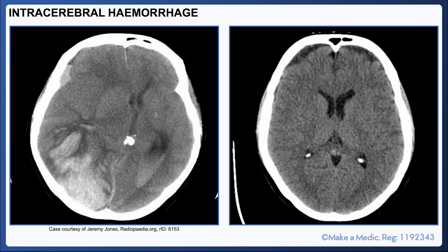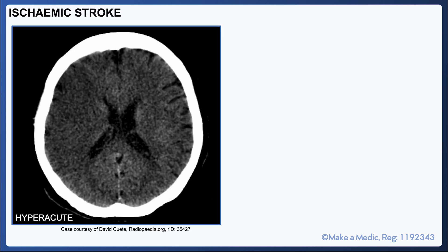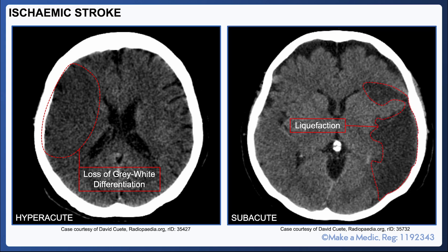In an intracerebral hemorrhage, you can see an area of extravasated hyperdense blood within the brain parenchyma itself. The appearance of a stroke on a CT head scan varies considerably depending on the time since onset. CT head scans are initially done in the acute setting to exclude an intracranial bleed. An early sign in ischemic stroke is loss of gray-white differentiation, and after a few days the infarcted area will liquefy and appear hypodense.